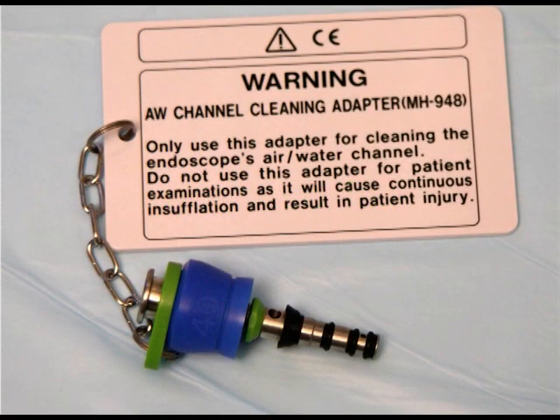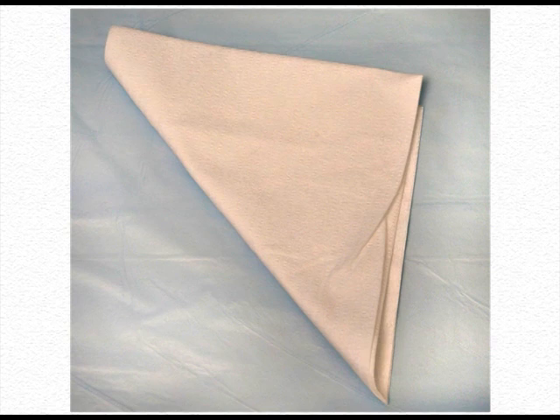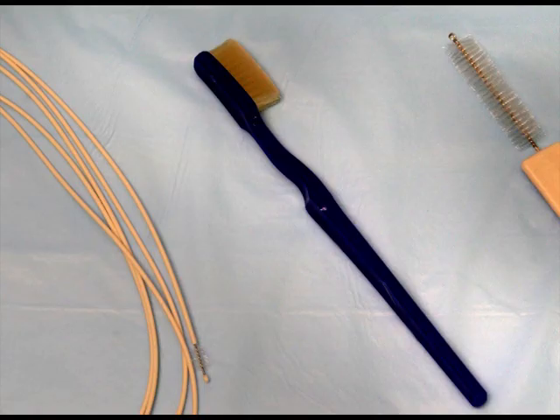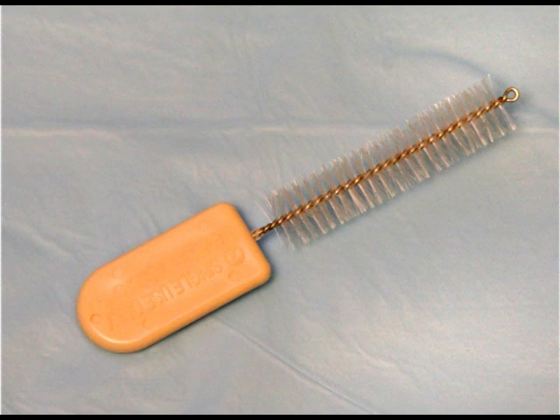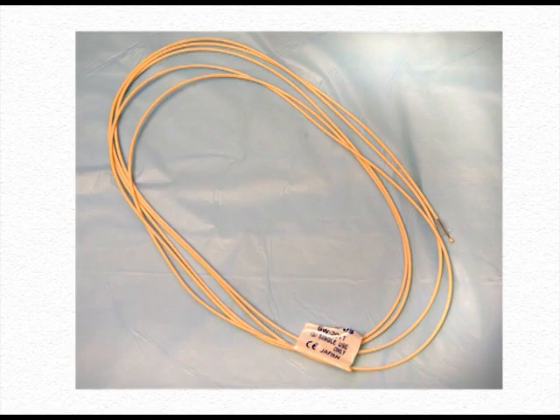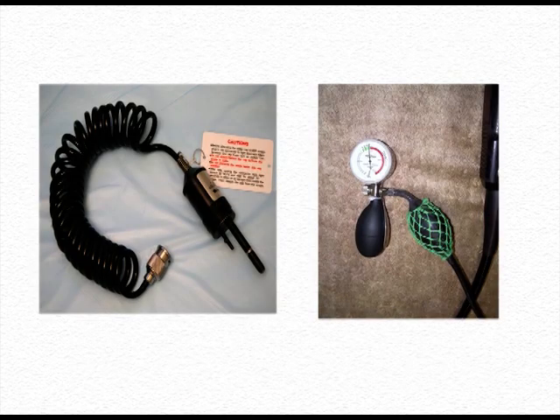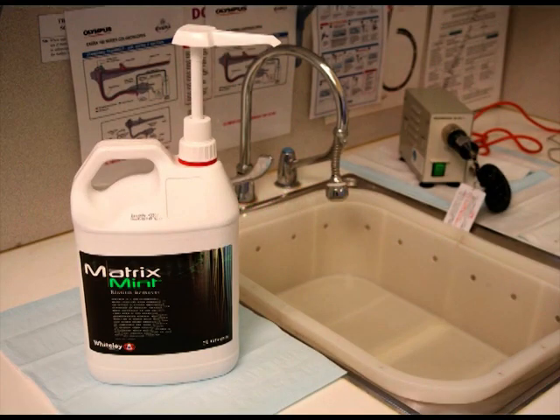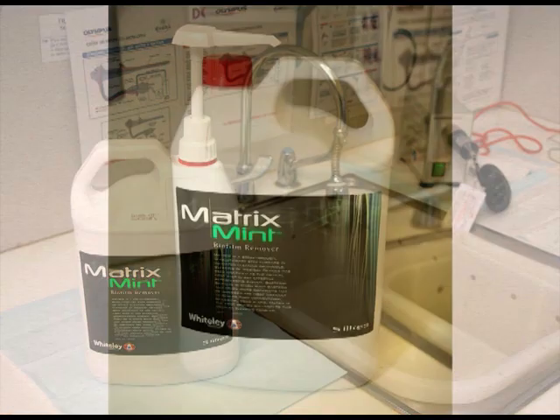Required accessories include cleaning adapters and syringes, lint-free cloths, octopus or flushing systems relevant to your endoscope brand and model, a toothbrush, a short stubby brush, a brush for each channel selected for the correct size, and a leak tester. Chemicals required include an enzymatic solution or a biofilm remover such as Matrix.